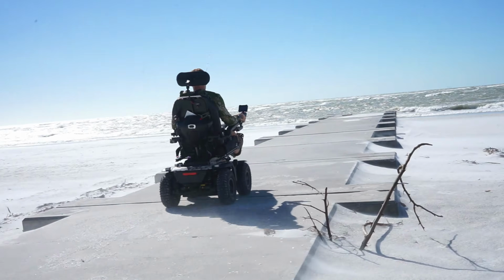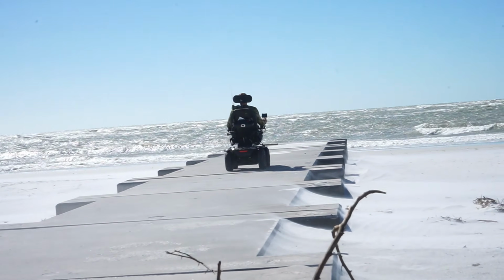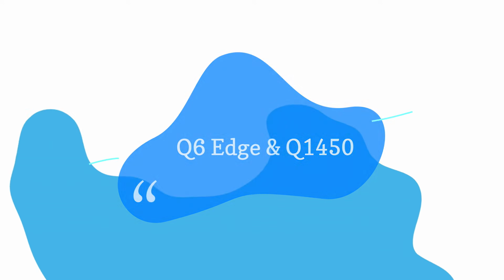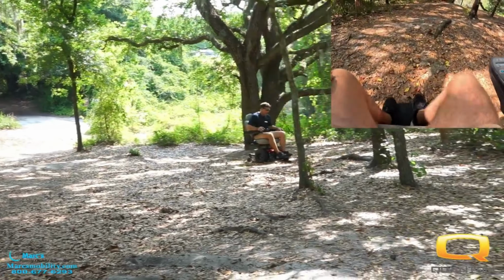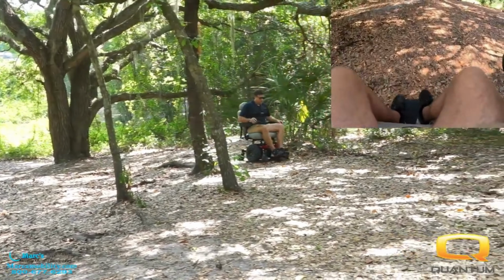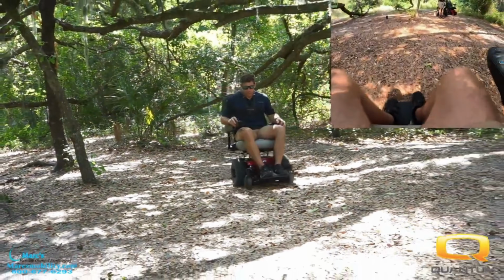Now, it does come with 4 pneumatic 15-inch drive wheels. That is standard. There is no other option of different drive tires at this time. So each tire is the same 15-inch pneumatic wheel. A little side note as well: we do sell some of the Quantum Edge units, and we put the large knobby tires on there. We have some videos out there that show the different driving when you have the knobby tires or the non-knobby tires on the unit. So if you are looking for one of those, we do sell those gently used at a pretty reasonable price.